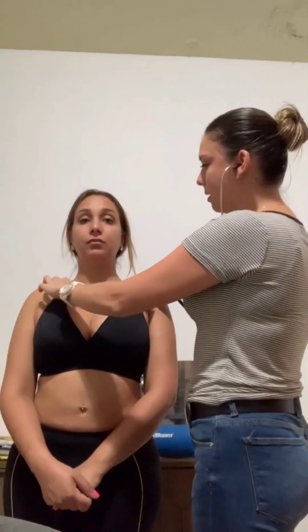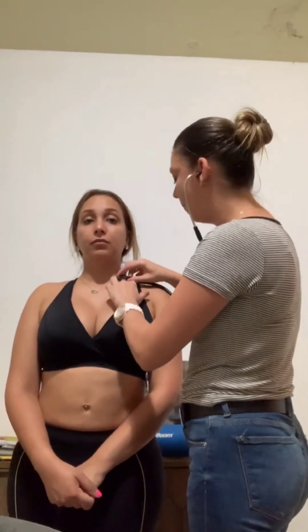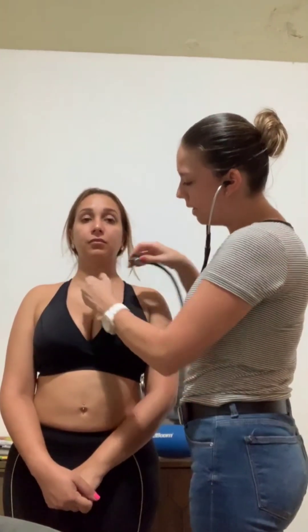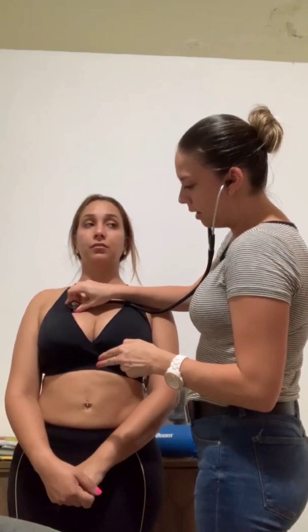Now I'm going to have her turn forward and auscultate her breath sounds. When I'm doing that, I'm listening for abnormalities such as crackles, wheezes, those type of things. I'm going to use the diaphragm of my stethoscope and start at the apex — right about here. I'm just listening for the thump, thump, thump, and I'm going to go on both sides. Then I'm going to work my way down to the sternum at the second intercostal, and I'm going to listen again.